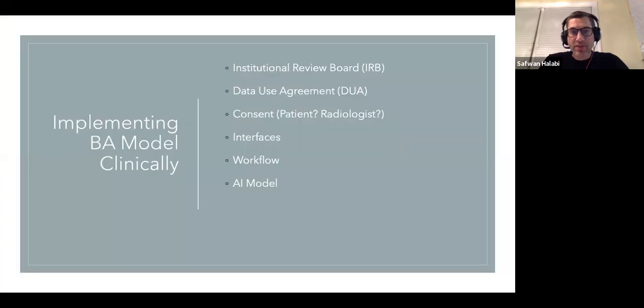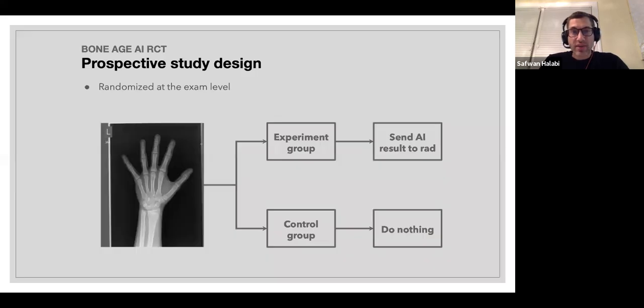But I wanted to talk about our implementation of the model clinically here at LPCH. After IRB, data use agreements, consent with the radiologist, and developing the interfaces, workflow, and AI model, we created a randomized control trial that took an experiment group and a control group.